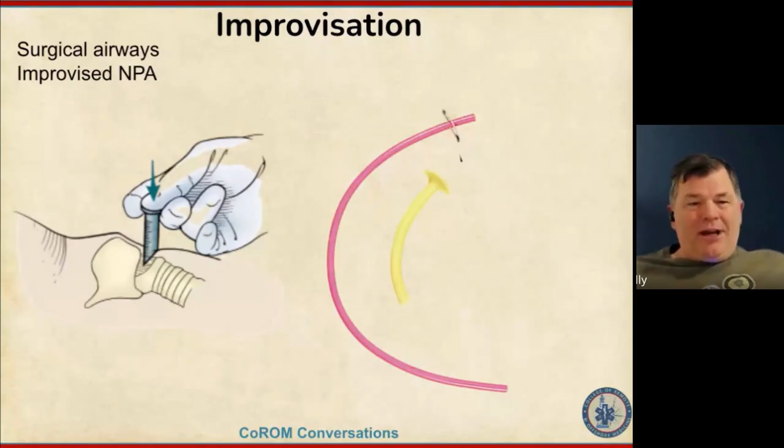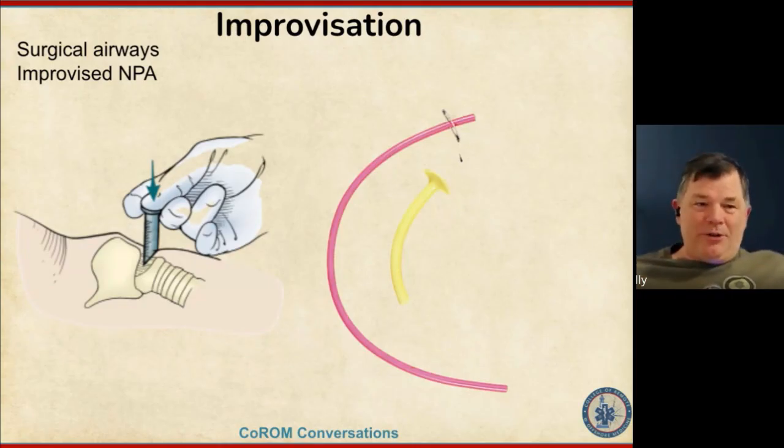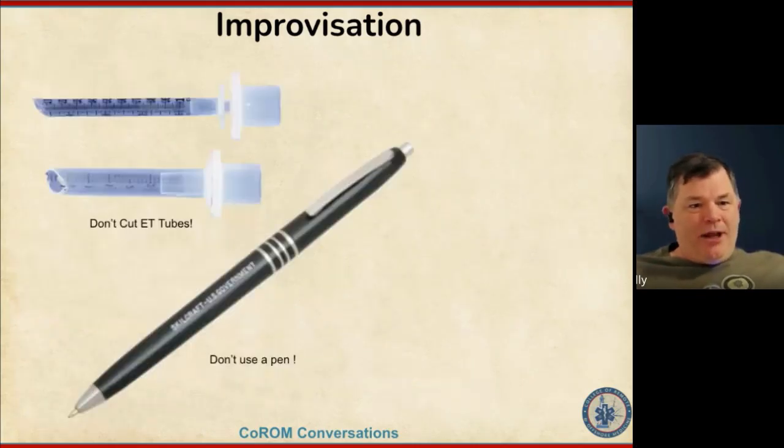So when I teach this, and at SOMA we're going to have an improvised medicine workshop, you can just give someone a 6 mil Cric kit, have them put it in their mouth, and see how long they can breathe. They're just not going to do well. And it's the same for, what's the next slide? I have the biro, the pen.